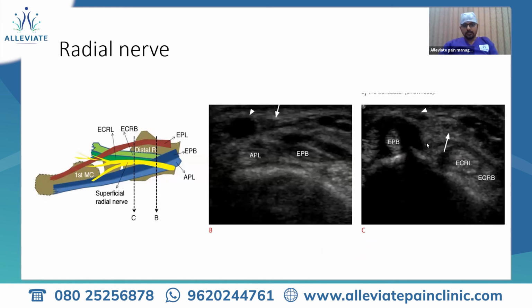So this is compartment 1. Okay, so where is the nerve now? At this distal level, it is in close association with the cephalic vein. So if you see the causes, there are very unique causes, like even cephalic vein cannulation has been known to cause trauma to the nerve, right? And in the Colles fracture, the stabilization pins, because it is closer to the distal radius, those pins have been one of the causes for involvement of the sensory branch of the radial nerve.